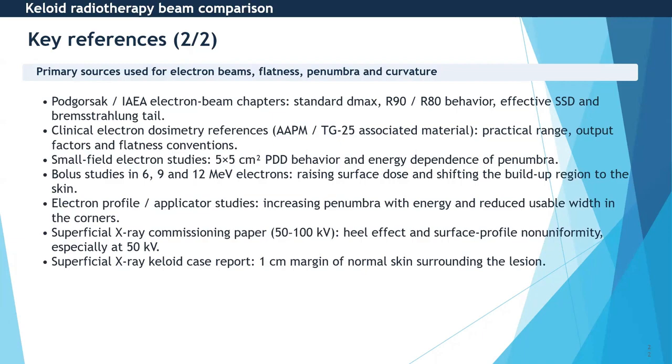It takes longer, as you may have seen from Dr. Sau's slides with the electron linac. It takes a bit longer to set. It's a more complicated system to set up. Yeah. Thanks.